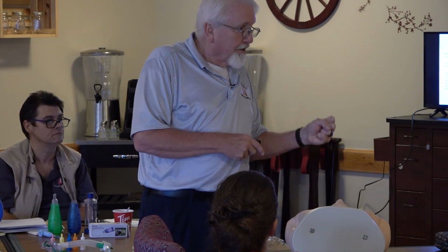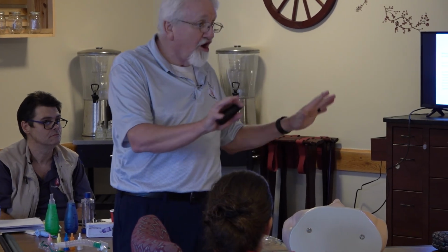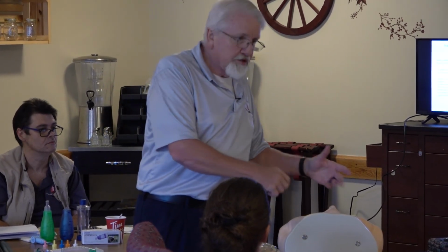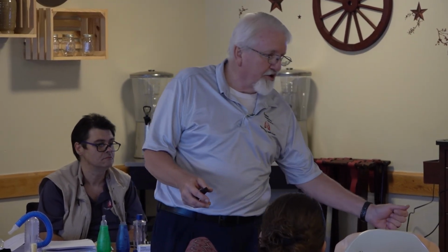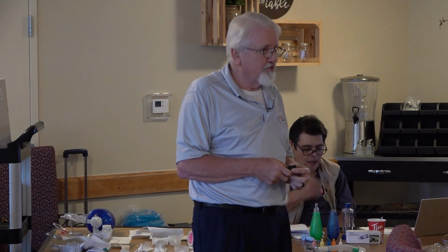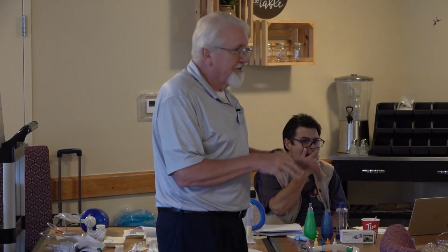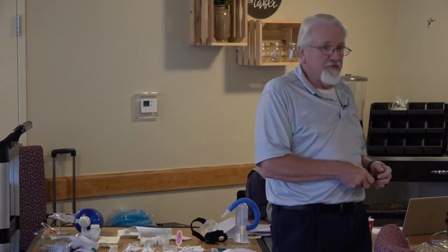Sometimes with floppy airways, it will literally grab your catheter, and you'll think, it's not coming. Don't pull on it. Stop everything you're doing. No suction, just let the tube sit there, because in a minute or so he's going to stop coughing, and you'll get it out. That does happen, so don't panic when they start coughing and the catheter won't move, okay?